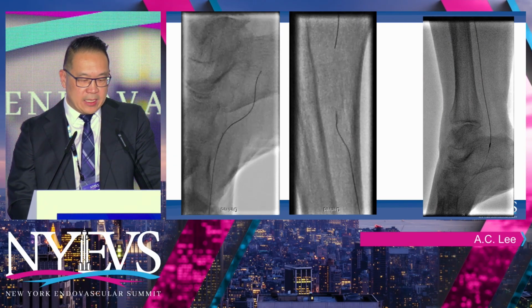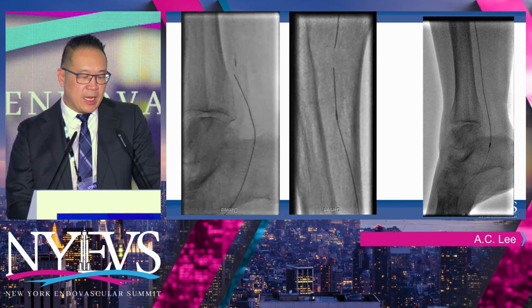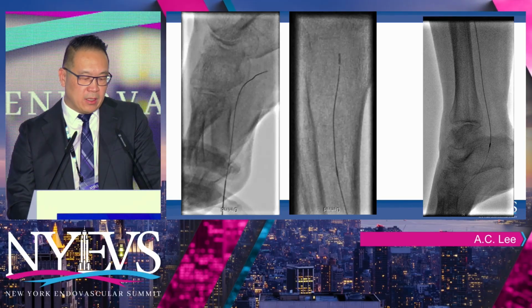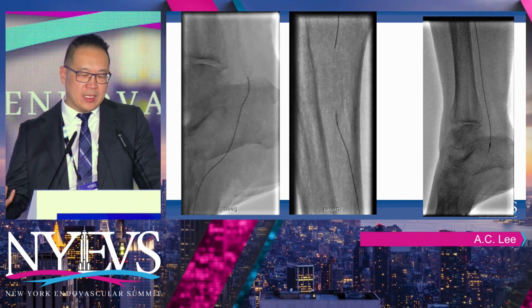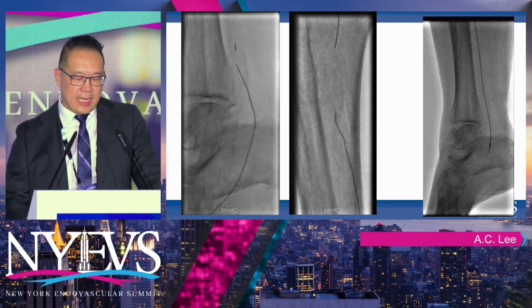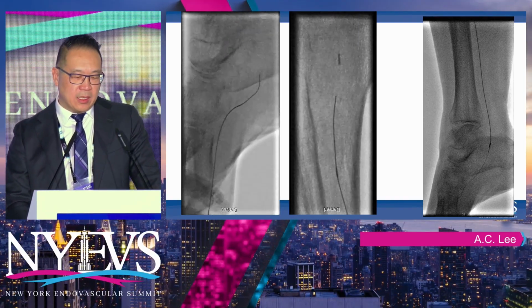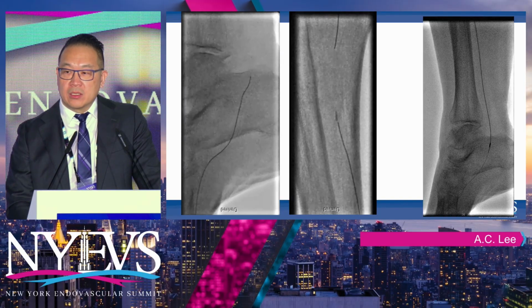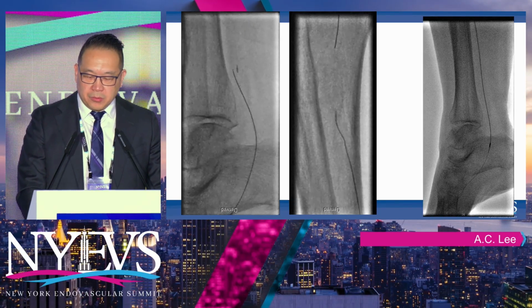We bring this V18 wire, and you'll see as it passes by my antegrade catheter that my antegrade catheter is probably off target. When I see that and it feels good from retrograde, I like to bring this base of operations as proximally as I can, because if I dissect proximally, at least I have the ability to sort of bail out with stenting with BVS or DES right now.